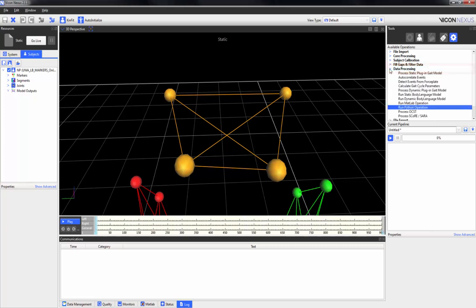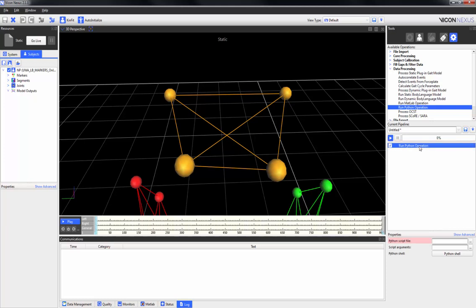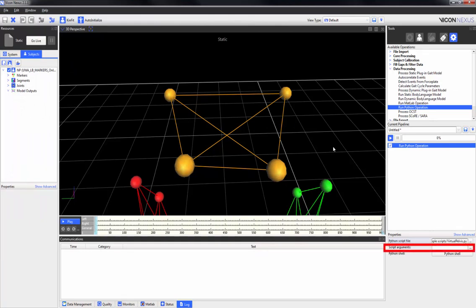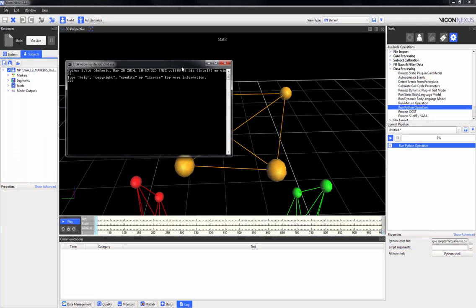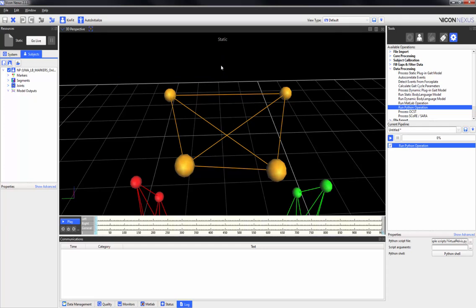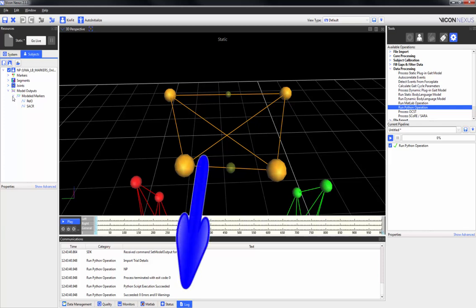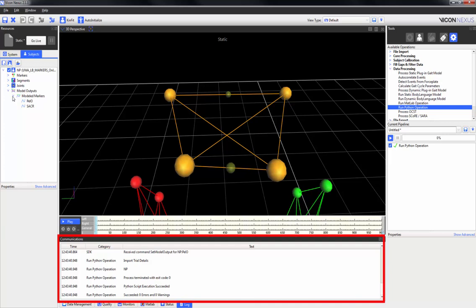To execute the Python script, go to the Data Processing heading and select the Run Python Operation. By highlighting the Run Python Operation in the current pipeline, we can edit the properties — in this case we need to select the Python script file and navigate to the folder containing the relevant script, then double-click to select it. This script doesn't require any arguments, but we can also launch the Python shell if needed. When we hit play, the modeled markers are created in the 3D workspace and appear in the modeled markers list. As the code executes, the communications log window is updated accordingly, and any errors will be displayed in the log and can be debugged.